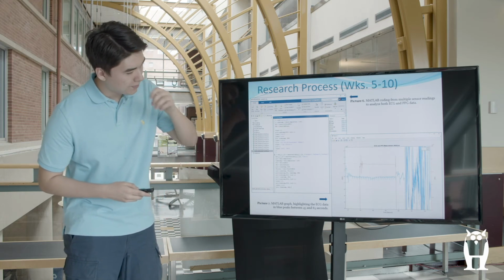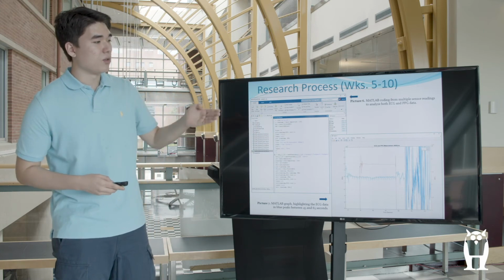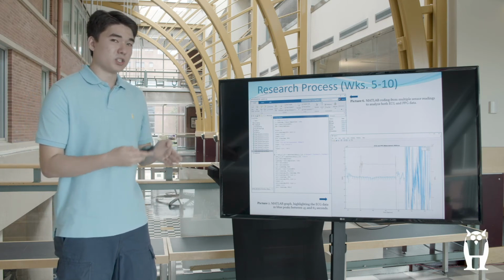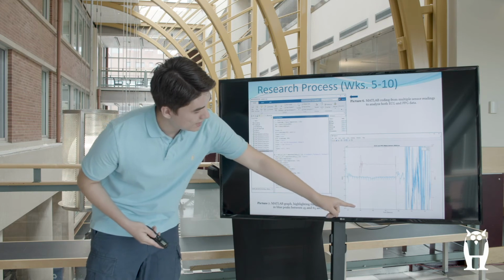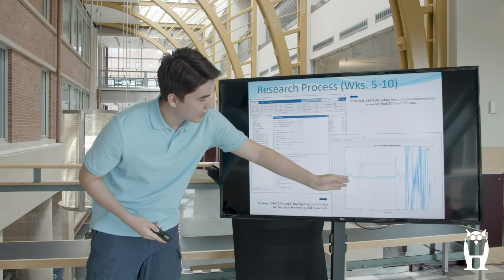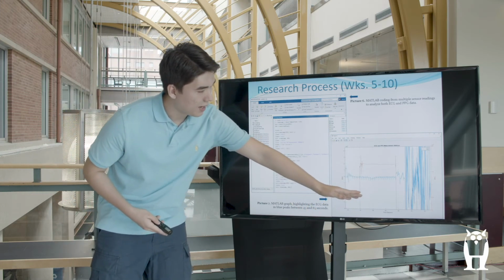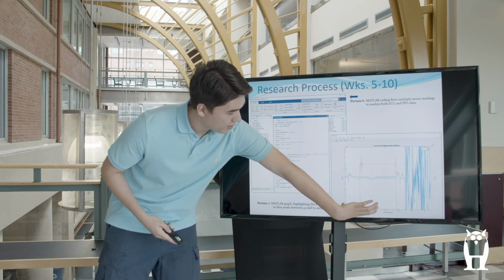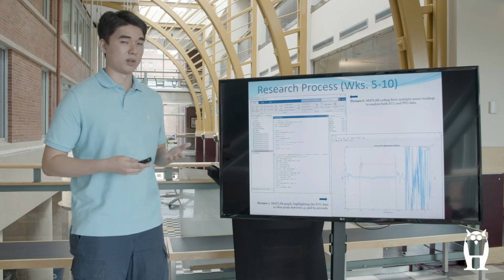I really enjoy this graph because it shows how you can get a very good result and how you can get a maybe skewed result at the same time. As you can see here, between 45 and 65 seconds, there are very accurate, steady PPG and ECG signals that are working very well. And then after 65, the instrumentation goes a little bit haywire. But this portion of the data really shows that the ECG and PPG sensors are working well.